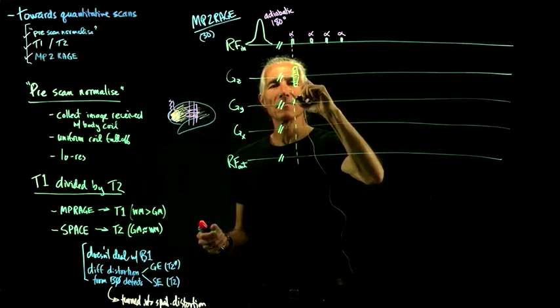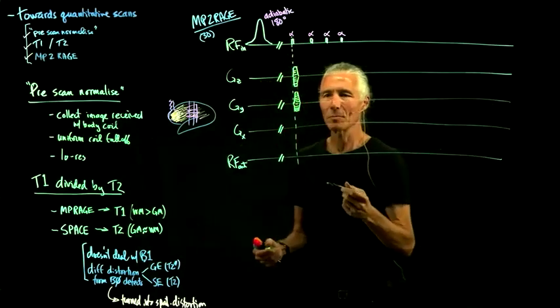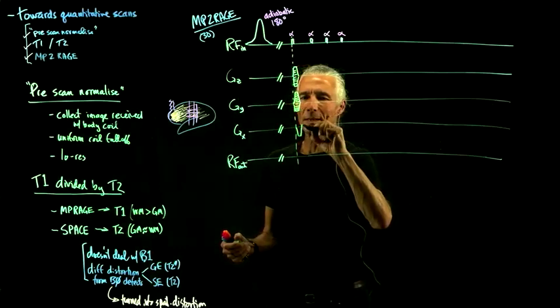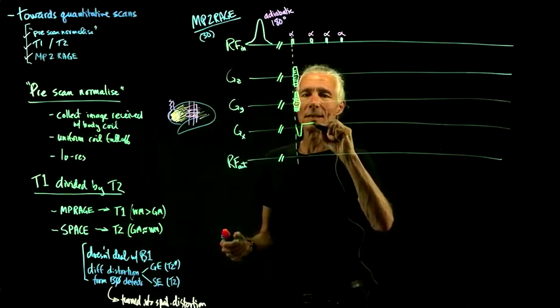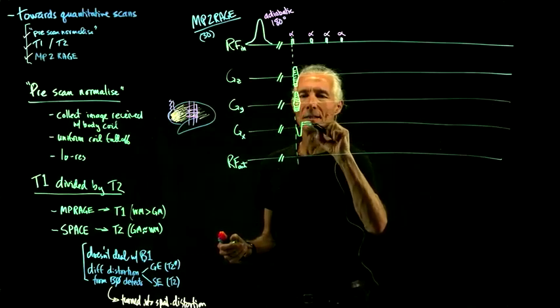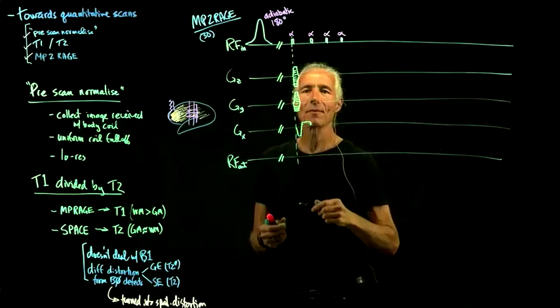And then some phase encoding on the regular phase encode direction, which is not different at all, except it's a different direction in real space. And then we do a readout, we go to the left side of k-space, and then do a readout like that, and collect one line of k-space.